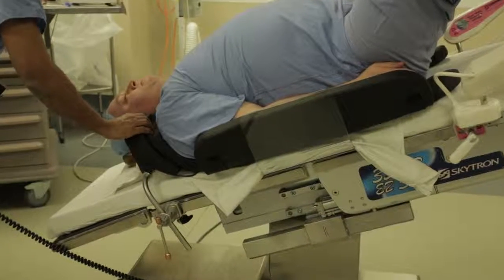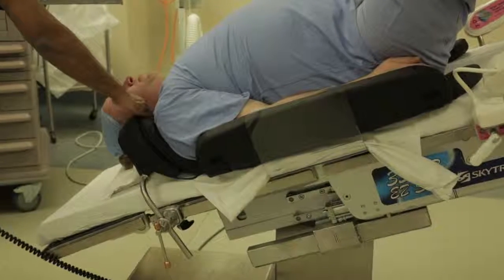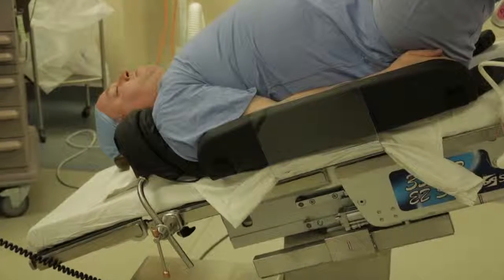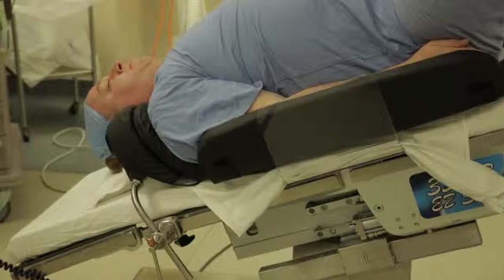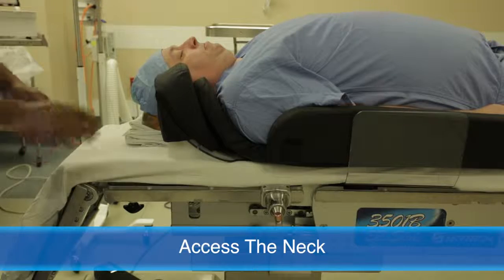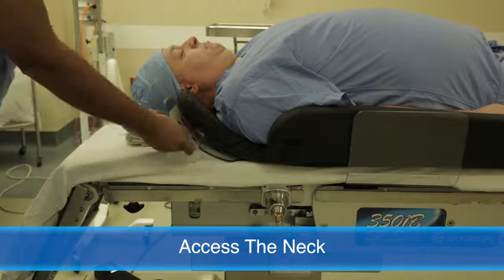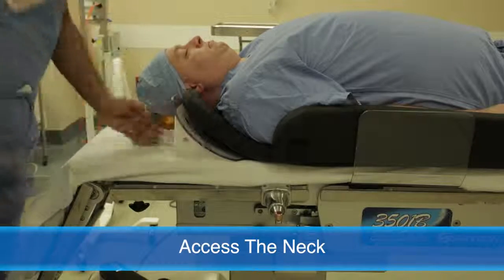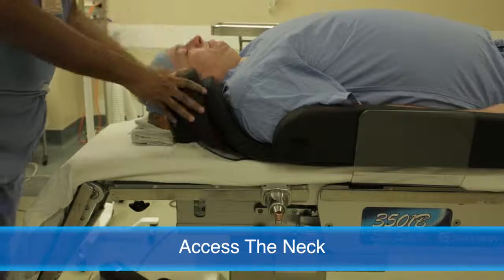This space will be maintained when the patient is in Trendelenburg. The anesthesiologist can check periodically during the procedure to ensure there is no focal pressure on the top of the shoulder. Once the patient is under anesthesia, you can access the neck by removing the TPS shoulder supports. When finished, replace the block before returning the patient to the Trendelenburg position.